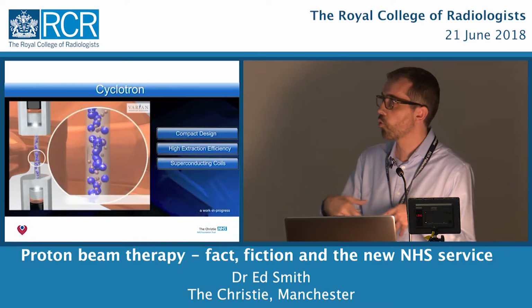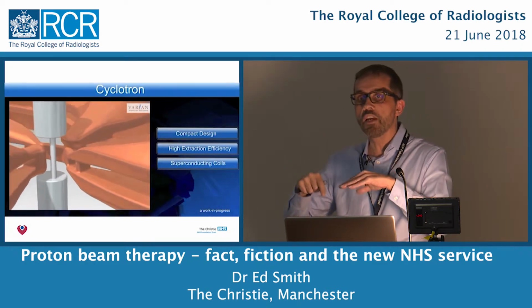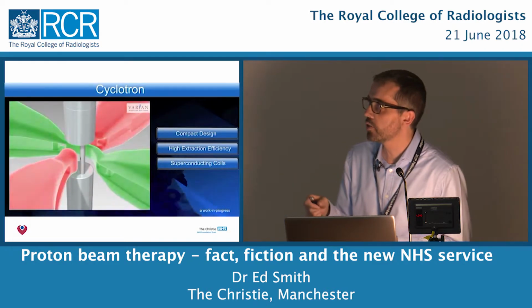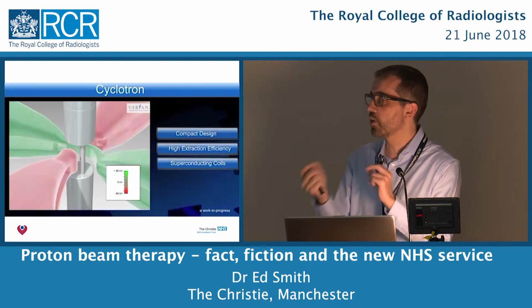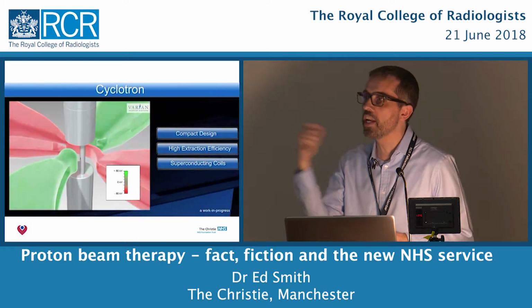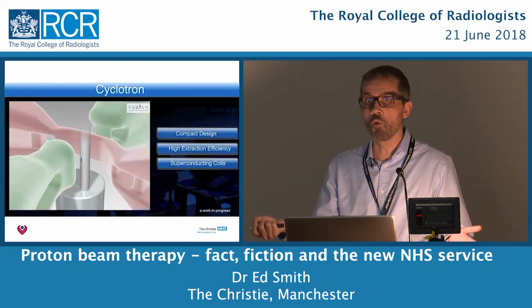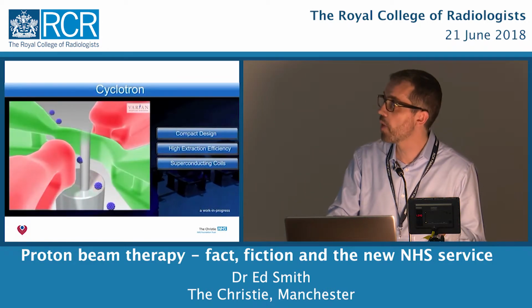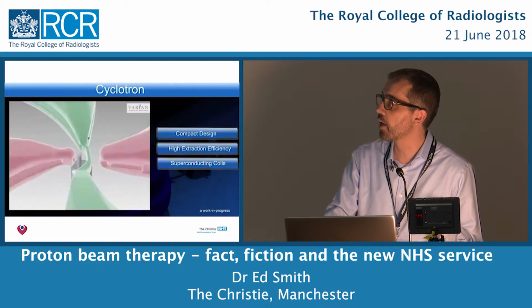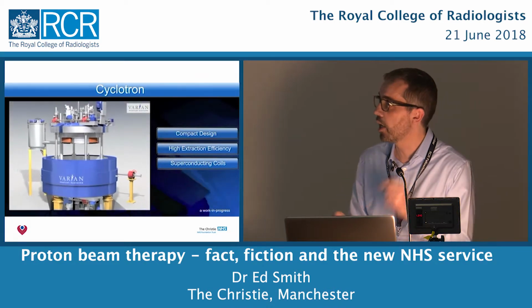And within the cyclotron, once the protons are produced, you've got these alternating fields on what are called D plates. And what that does is it simultaneously attracts and repels the protons. They start spinning round very, very, very fast, hence cyclotron. It's a bit like a washing machine. When they get to the edge, they're so fast, they come out of the cyclotron and down the beamline. And that's where they will travel to the patient.